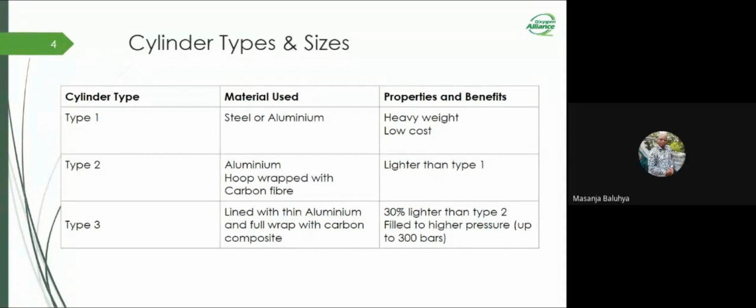Well, does the person who is entering the MRI really need the oxygen? If so, fine. But if the way the MRI works doesn't allow oxygen, then why should we think of a cylinder that is compliant with the MRI? Well, just thinking aloud. Thanks.